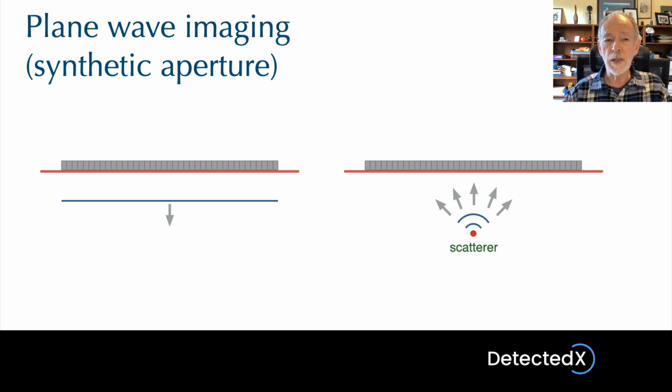Now there are disadvantages and very major engineering challenges in doing this. So at the moment, the machines which use this technique are actually using a sort of hybrid, somewhere between this technique and conventional imaging with the formation of beams, stepping of the beams, etc. So at the moment we're in a transition time between the conventional technology which I've described in my earlier lectures and this new synthetic aperture approach.